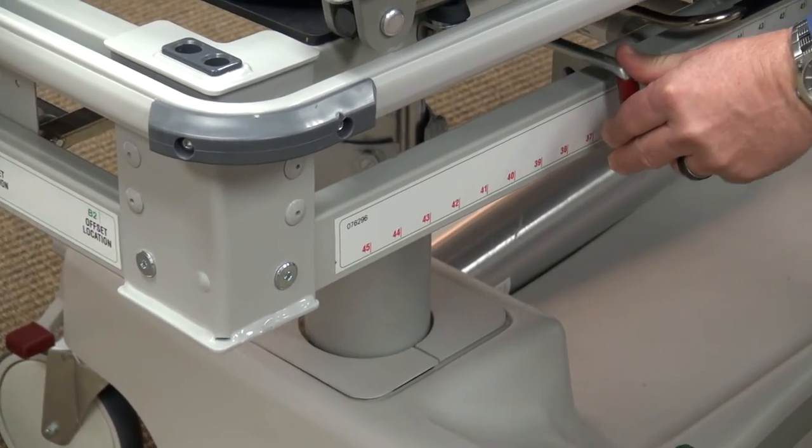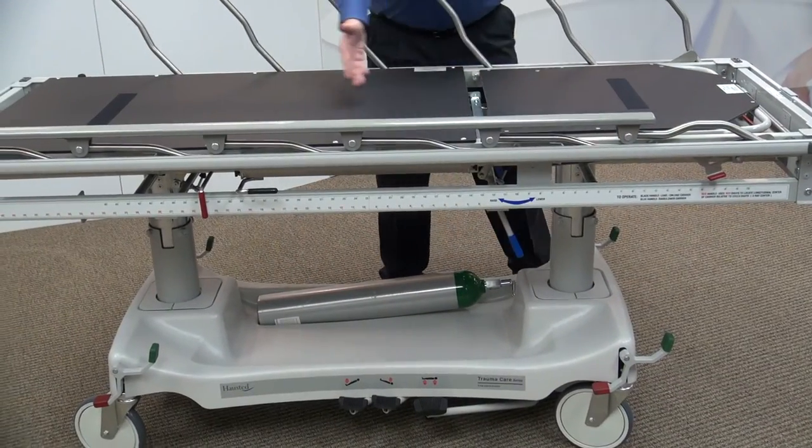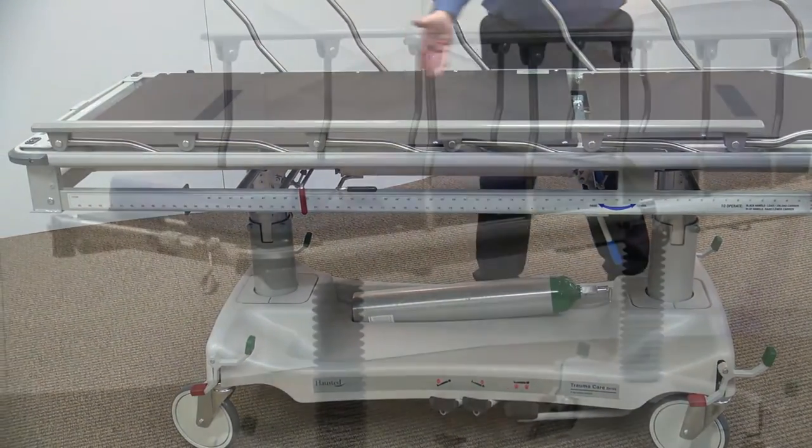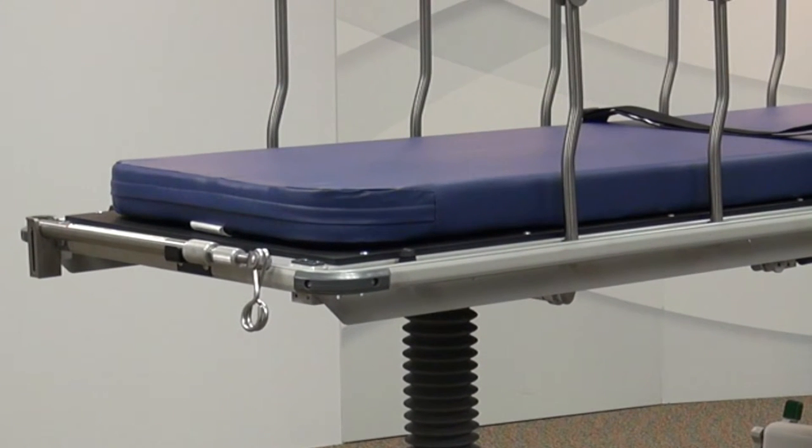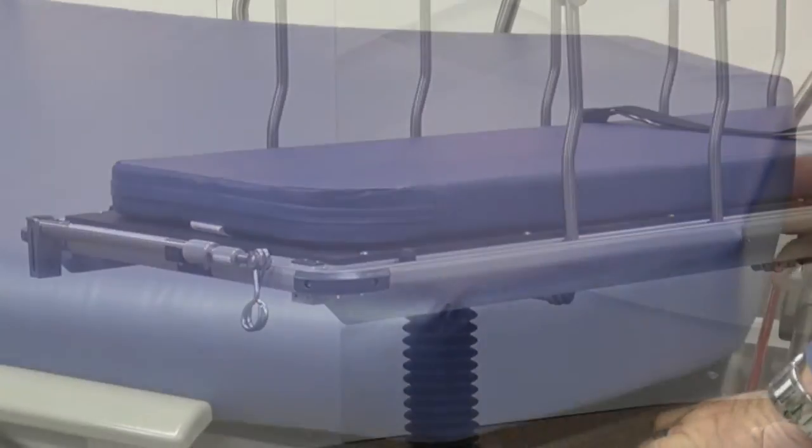The red cassette tray release handle can be used to move the tray. The X-Ray Trauma Stretcher features a 28.5 by 73 inch radiolucent top for clear imaging and a 3 inch thick mattress designed for patient comfort.